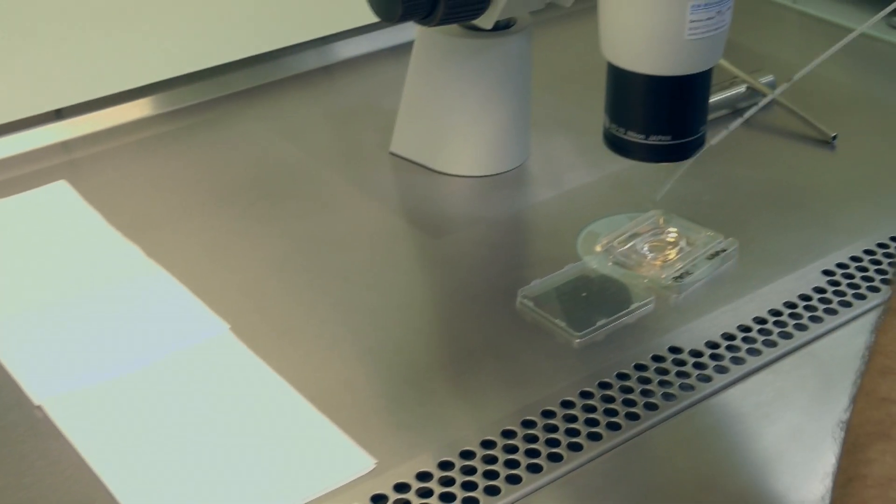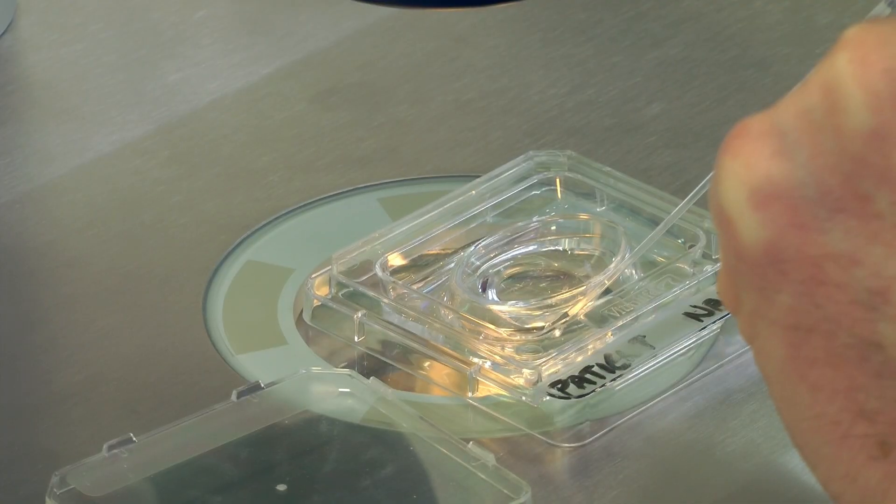After rinsing, draw 0.1 ml of Embryo Glue from the well of the dish and expel until 20 µL is left in the catheter.